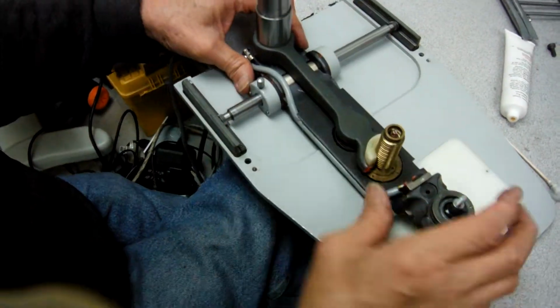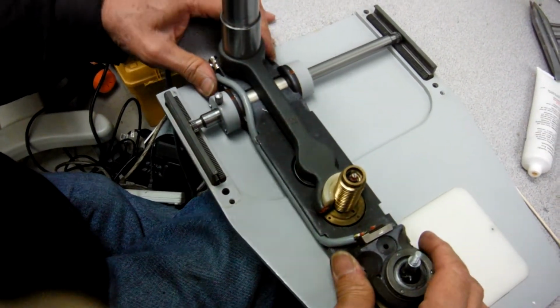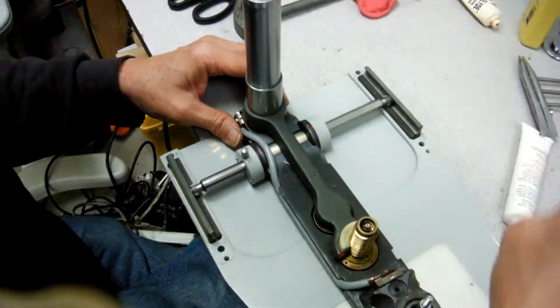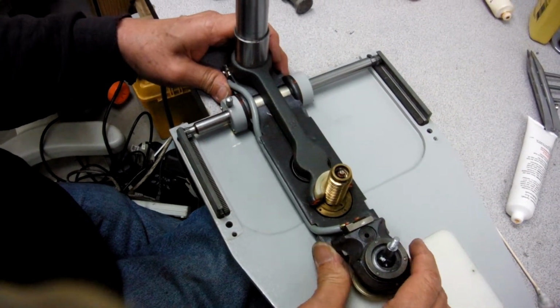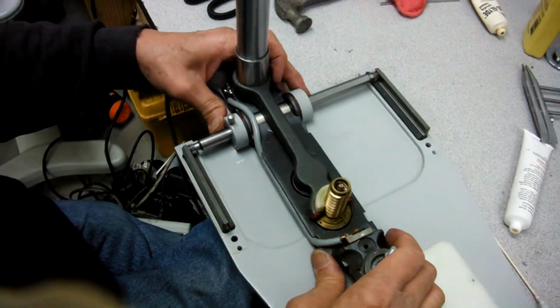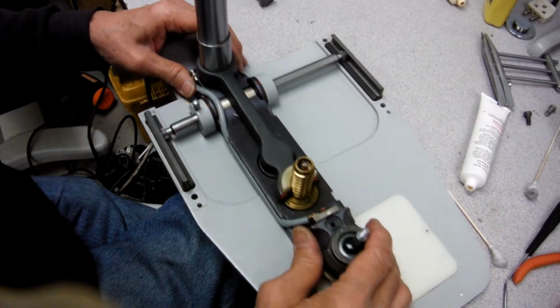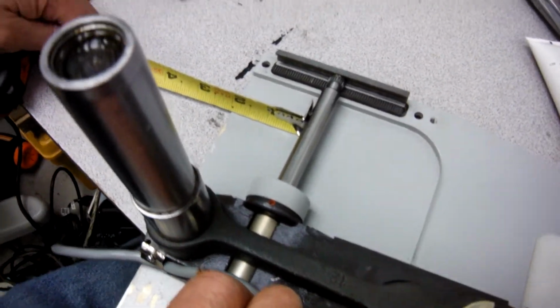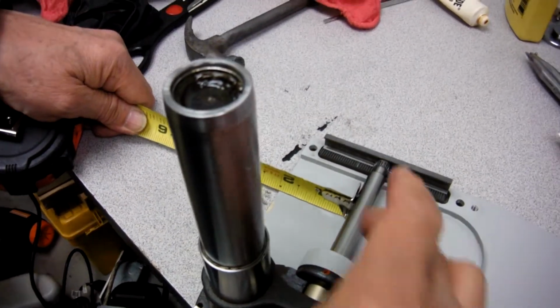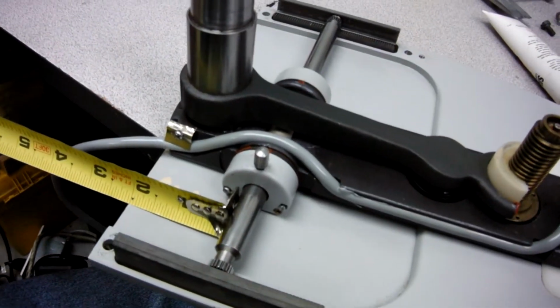Make sure you put the shaft in straight, because if it sits crooked, it's not going to run correctly. So if you want, you can use a tape measure from the front to the back right here and see if it measures about the same. Right now, it looks like one side is crooked. Okay. Let's say you put it on a 2 so it's easy for you to see. I'm going to put this right there at the 2 mark. On that side 2 mark, this side has to be 2 mark. That is actually correct, the way it's supposed to be.